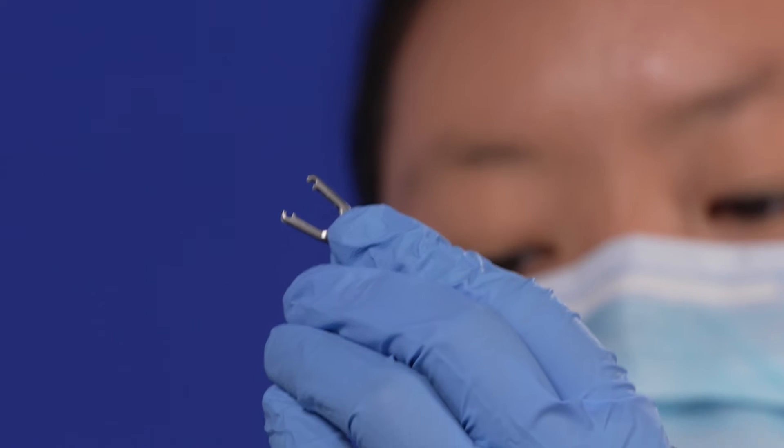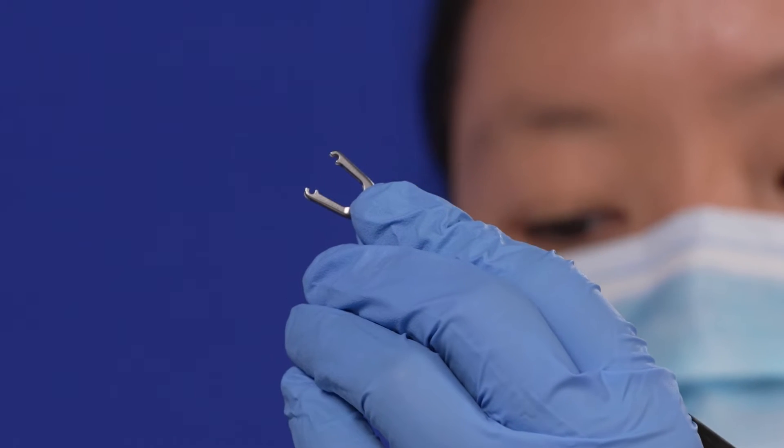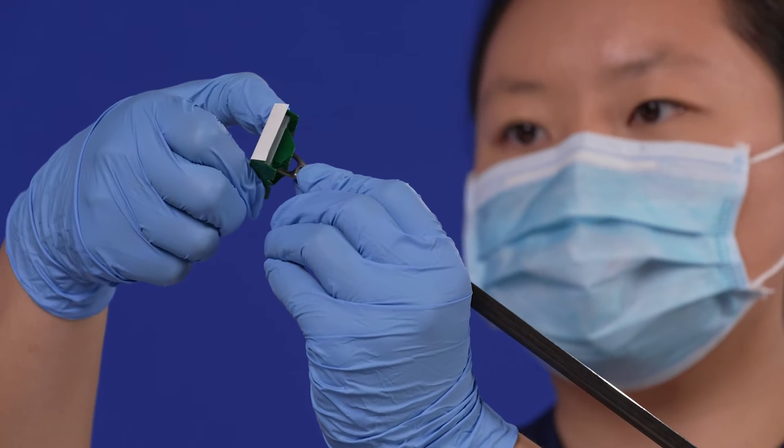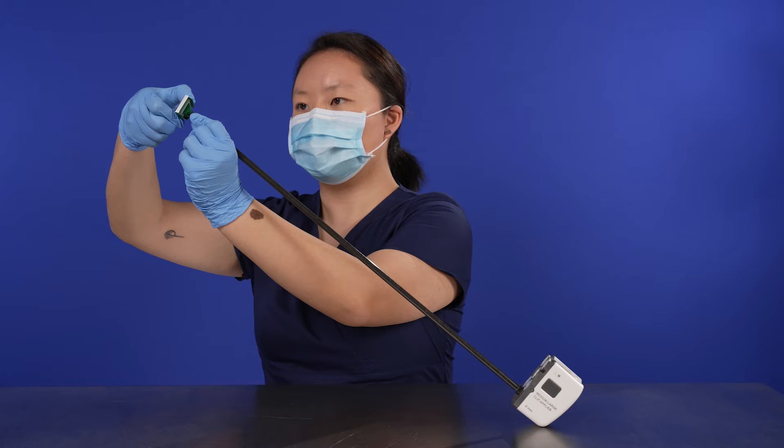Hold the instrument wrist completely straight and the jaws open. Carefully insert the jaws of the applier into the cartridge slot, making sure the jaws are perpendicular to the base of the cartridge.